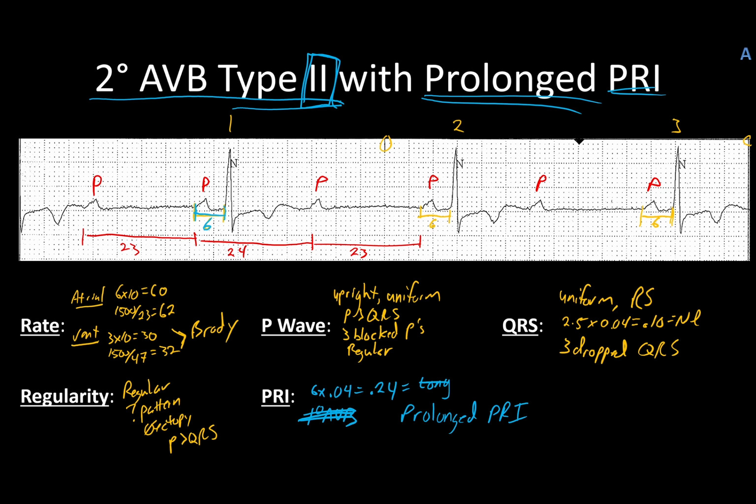And it just helps indicate everything else that's going on. So please keep that in mind going forward when you're doing interpretations, that it's worth noting when that PRI does wind up being long.